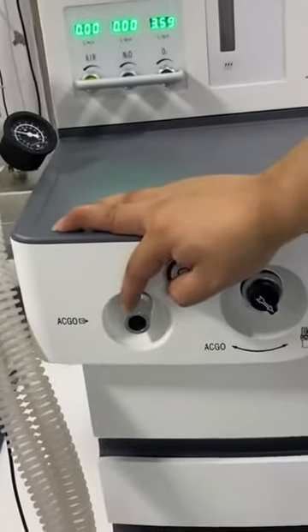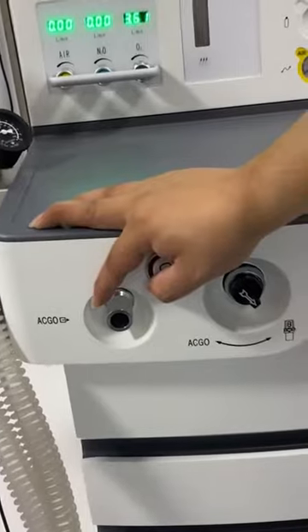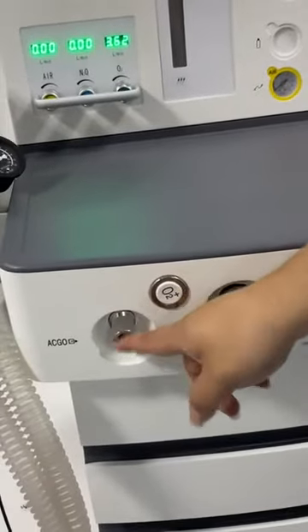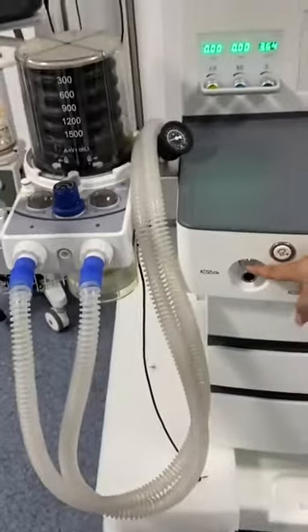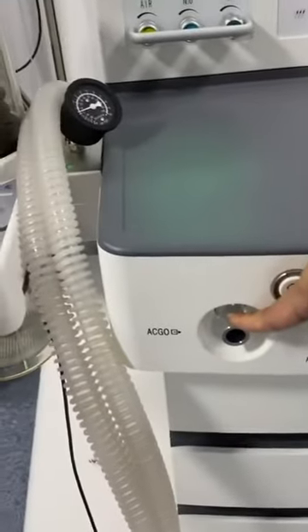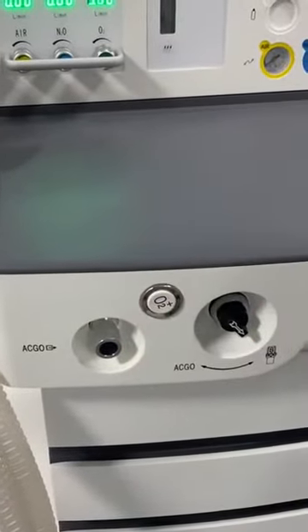The second one is that when a patient comes to the hospital suddenly, and the doctors need to give them an operation immediately, and they don't have time to judge if the patient has an infectious illness or not, they can also use this line, so it will not influence the main pipeline. And after the operation, you can just clean here, and it is okay. The third function is that this port can realize the open circuit for operation. So if you want to use the open circuit for this anesthesia machine, we just connect the device here, and then we can do the open circuit.